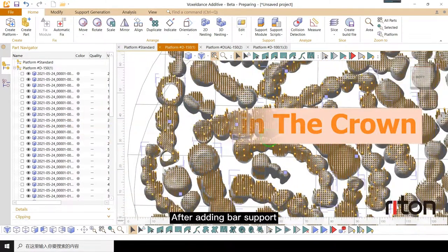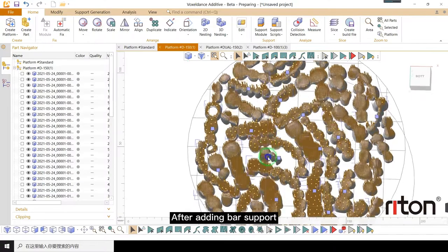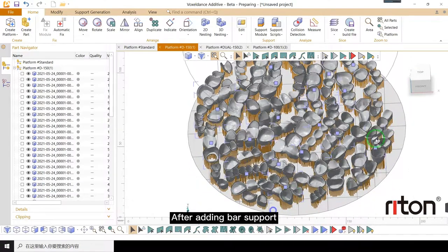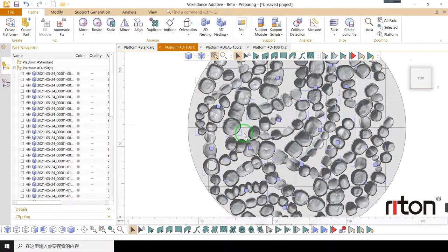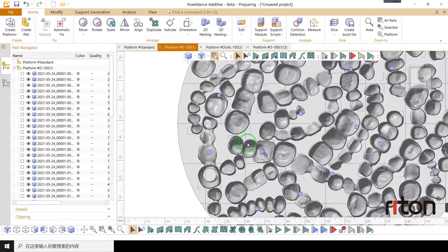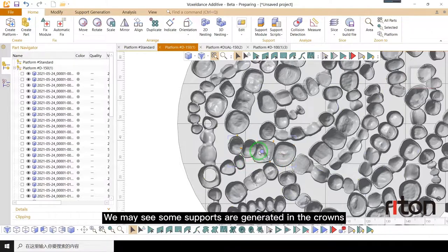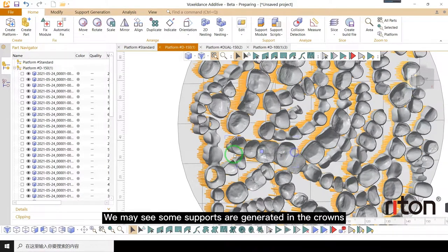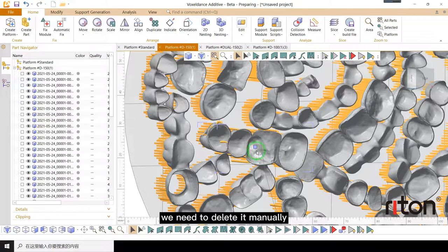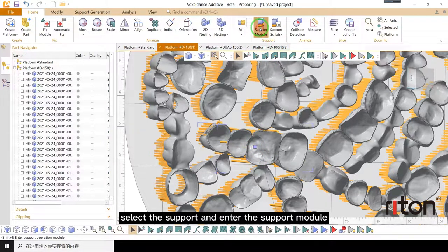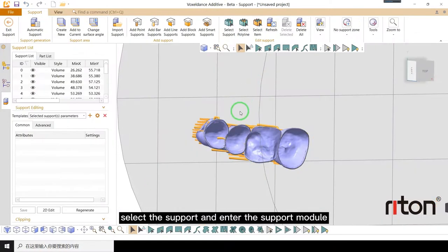After adding bar support, we may see some supports are generated in the crowns. We need to delete them manually. Select the support and enter the support module.